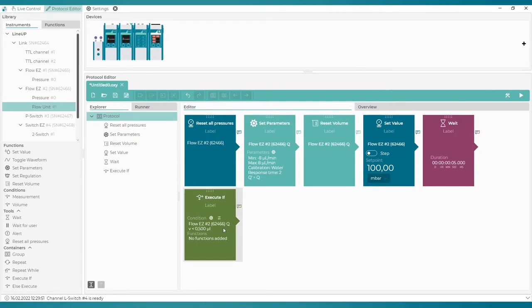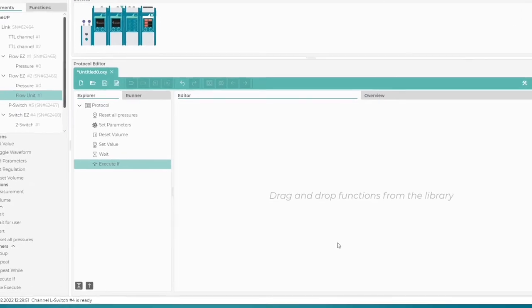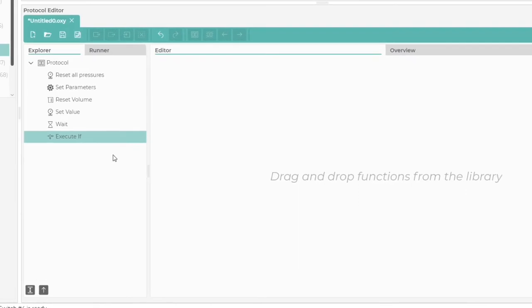To do this, we click twice on the Execute If block and go to a separate block layer dedicated to this specific Execute If. Here you can add any number of blocks, just like in the main protocol. In the Explorer tab, we can see that the Execute If block is activated.